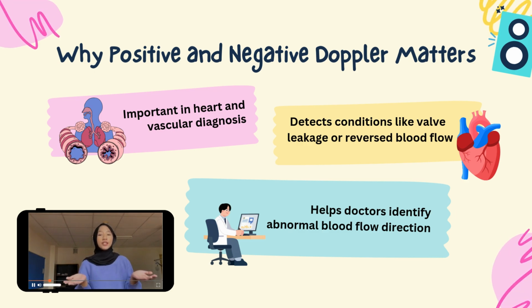And why are positive and negative Doppler shifts important? Because they help doctors understand how blood is flowing in the body. By showing whether blood is moving towards or away from the ultrasound probe, Doppler ultrasound helps identify abnormal flow directions.